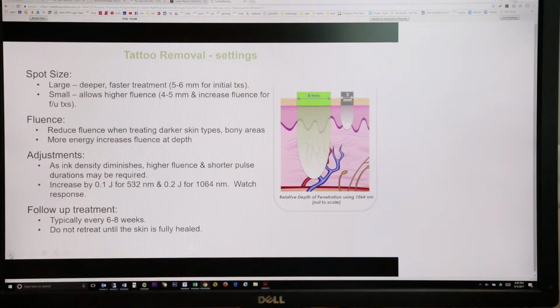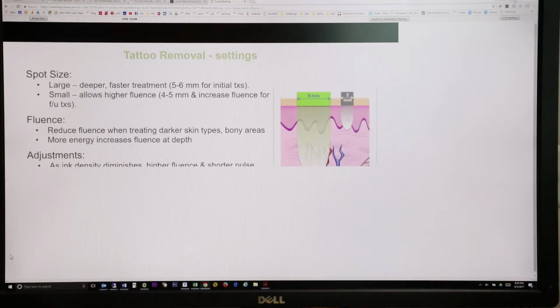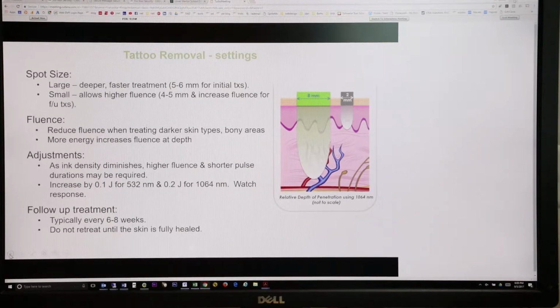Because I've seen providers go in when the tattoo is still a little bit tender, or possible bruising, or maybe even hemosiderin looking. So they go in, and that's just further damaging the tattoo. So I like to wait a little bit. Yeah. Okay.